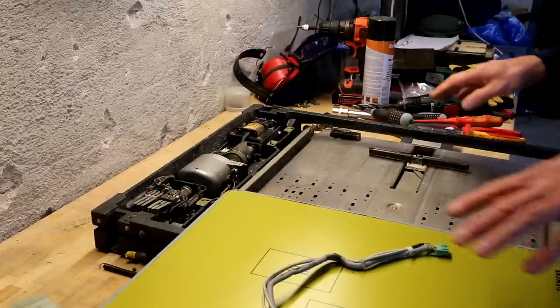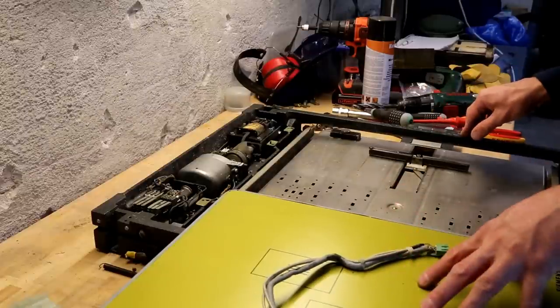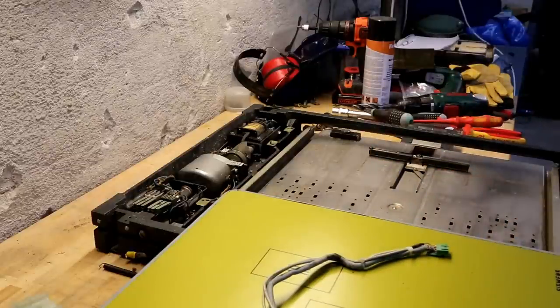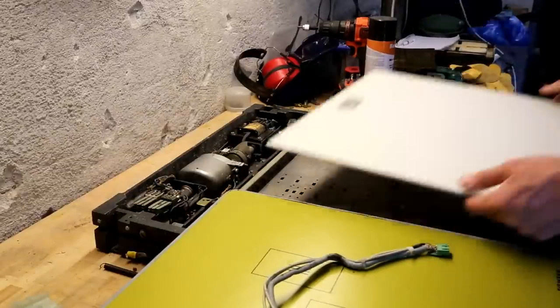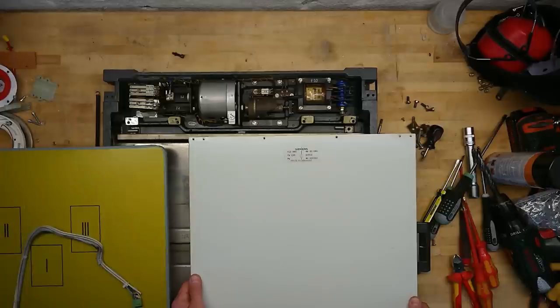So yeah, I hope you enjoyed part 2 of the X-ray system teardown. This was the image plate holder system, some kind of detector, grid plate. So yeah, write me a comment if you have much more knowledge about these parts than I do. I would love to know what these can be used for, or if others have uses for them. Because if I can't use them, others will have some joy from them, that's for sure.